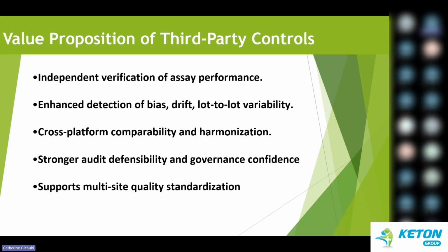We'll also be looking at the value propositions of third-party QCs, why third-party QCs are valuable. The first one is independence: independent verification of assay performance. There is an external check that is usually done to confirm it is working on a machine specifically. If you look at the inserts that come with the third-party QCs, every machine has its own ranges, the SD, the ranges, the target, specific for that machine. So it is an external check to confirm the machine is working correctly.